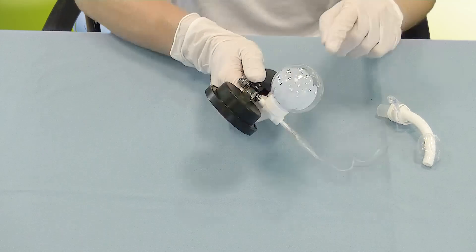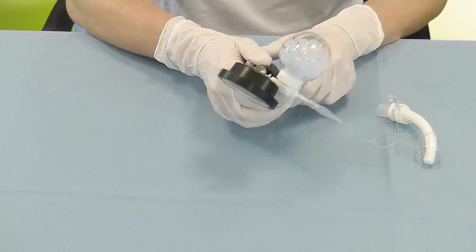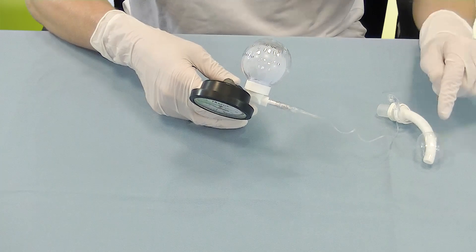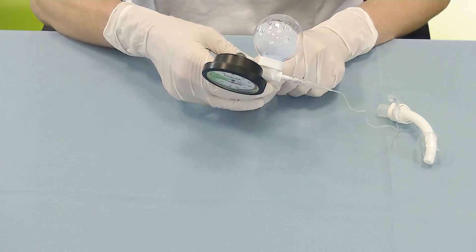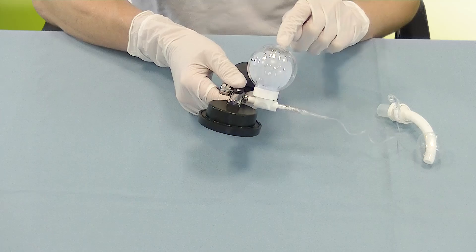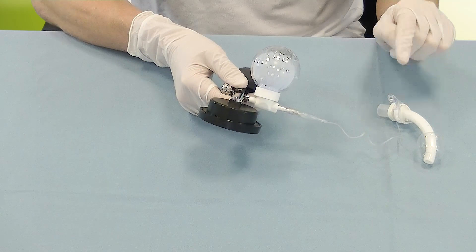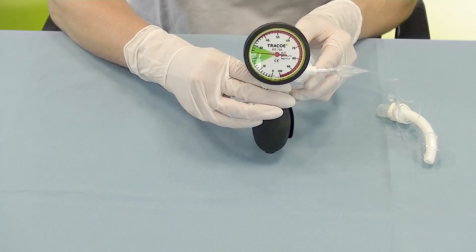It is inflated to two-thirds or three-quarters of its housing, and by doing so the TracoSmart Cuff Manager automatically inflates the cuff of the tracheostomy tube. The surface tension of the blue balloon then balances high and low pressures inside the cuff and regulates them to approximately 25 millibar.